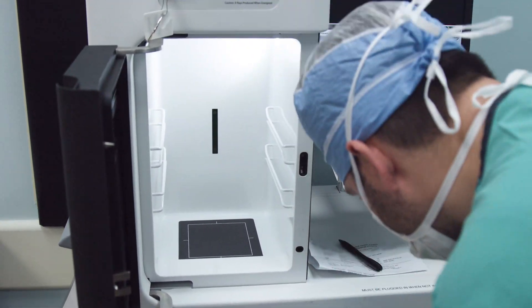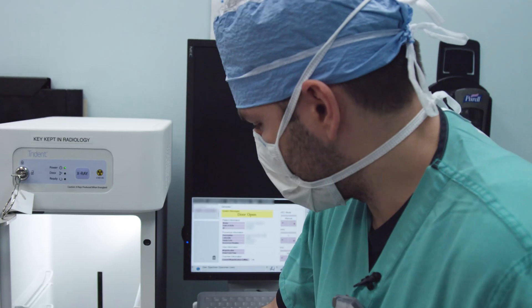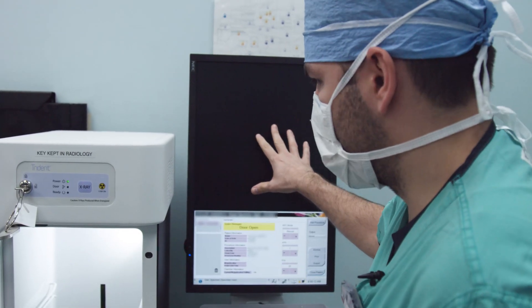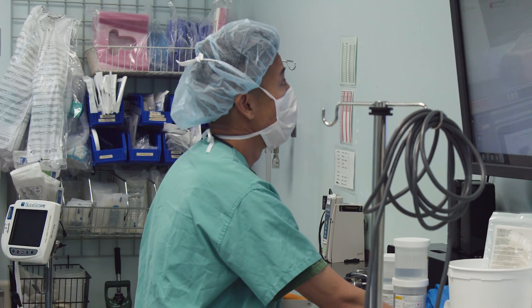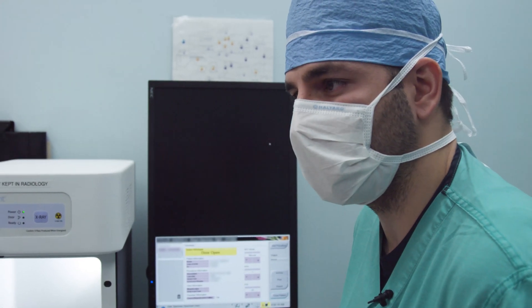We can also magnify the image if we want — times 1.5 or times 2. The image will pop up right away on our screen so Dr. Komenaka can look at it, and then you can contact Dr. Ferraro to review the images and make sure they got all the tissue out.